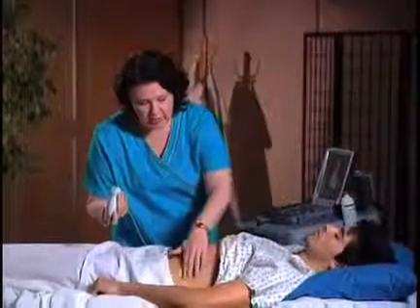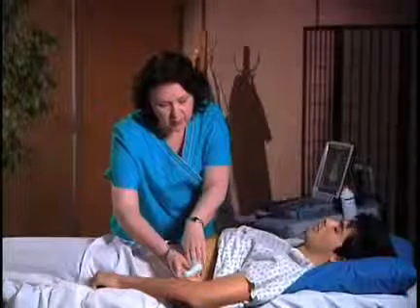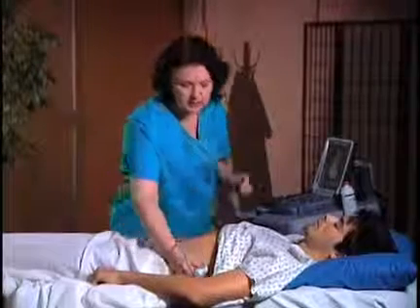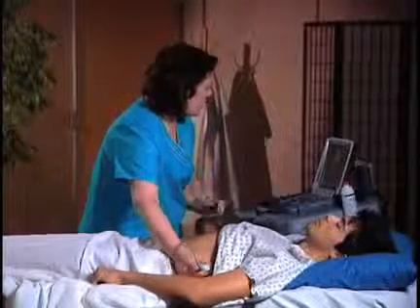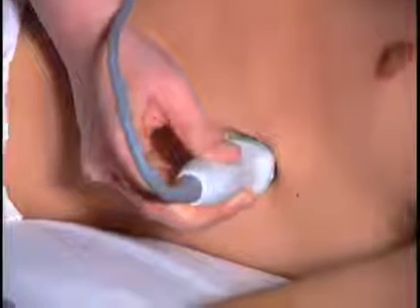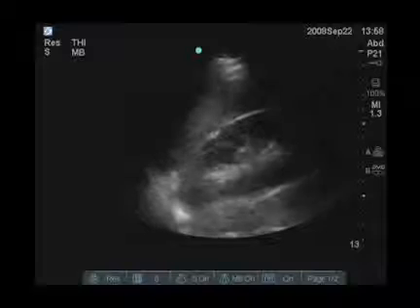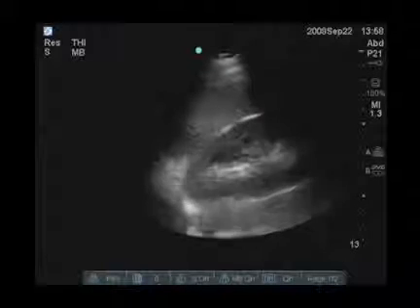An easy landmark here is to identify the costal margin, then move up one hand's width and bring your transducer in at the mid-axillary line. This should get us right in the area of the spleen and the kidney. You may need to move up a rib space or two depending on how high and how small the spleen is, because you're using the spleen as your window to evaluate the kidney. Moving up a little bit, I can see the superior part of the kidney. I'll sweep from side to side, again looking at the cortex of the kidney, the renal pyramids, and also trying to determine if there is hydronephrosis present.